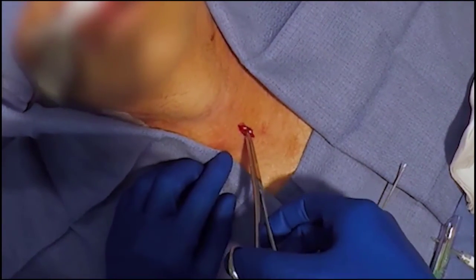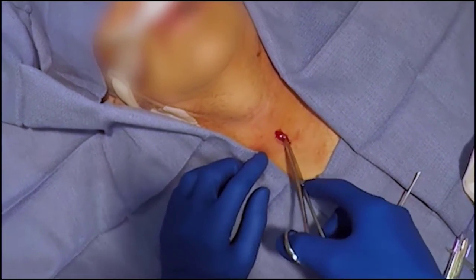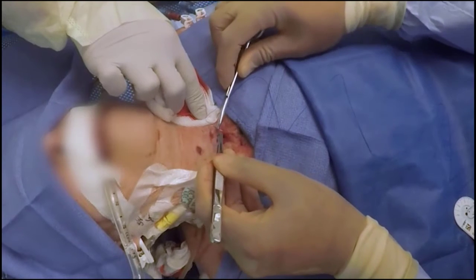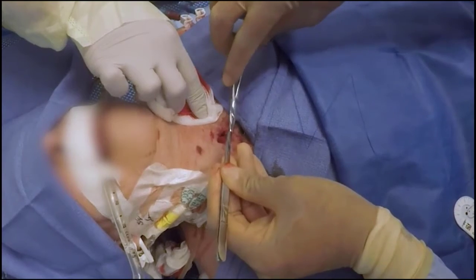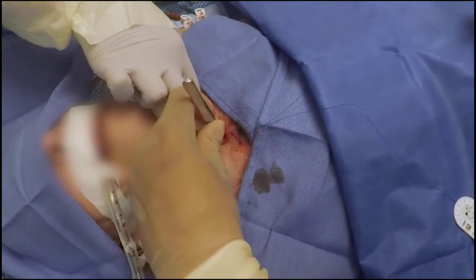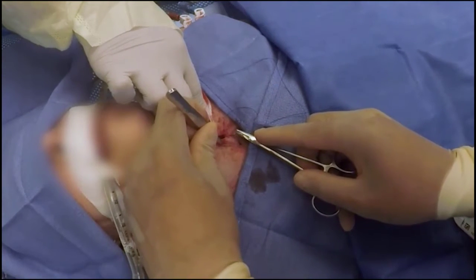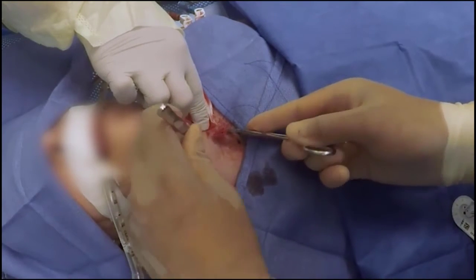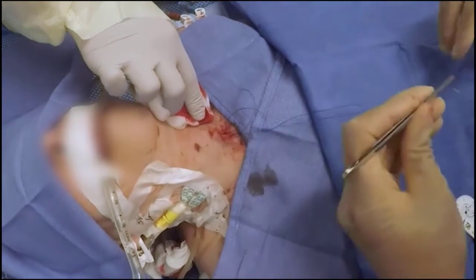Bluntly dissect the pre-tracheal tissue with a dissecting tool until the trachea is clearly palpable. In patients who require therapeutic anticoagulation or in whom there is any risk of bleeding, it may be advisable to place a purse-string suture around the tracheostomy incision with the use of a 2-O proline suture. The purse-string suture is placed but not tied during this step. It will be tied for additional hemostatic control once the tracheostomy tube has been inserted. The suture is generally removed on the second post-operative day if there is no evidence of bleeding.